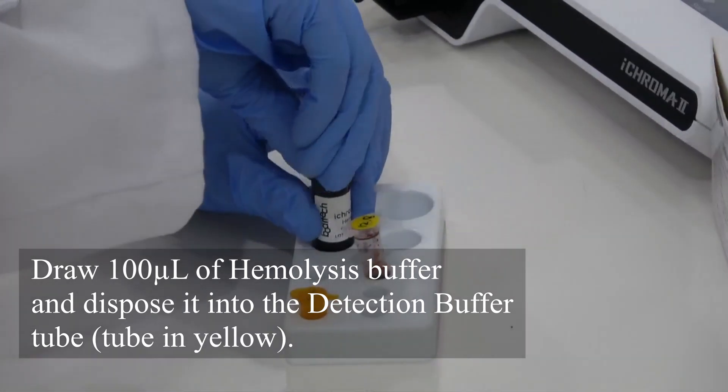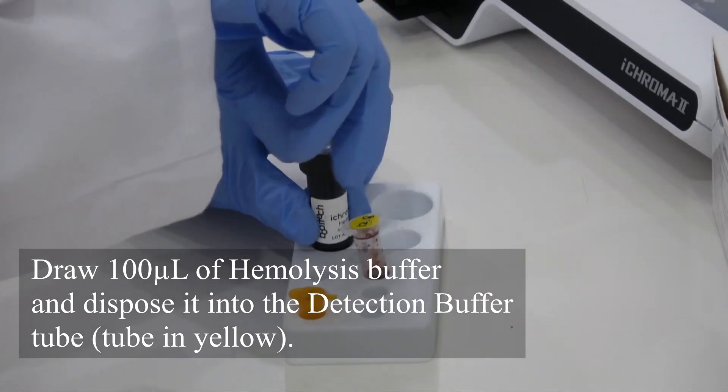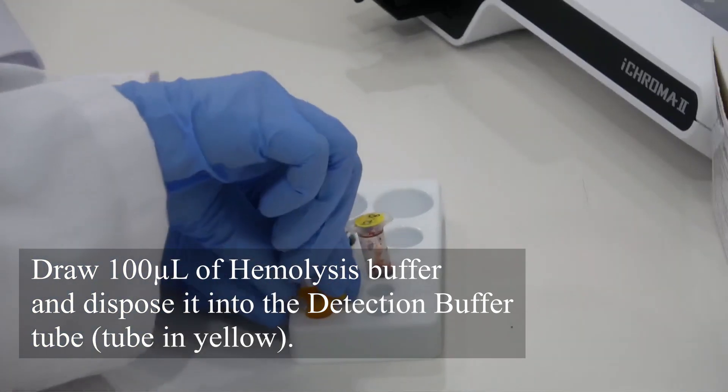Draw 100 microliters of hemolysis buffer and dispose it into the detection buffer tube.